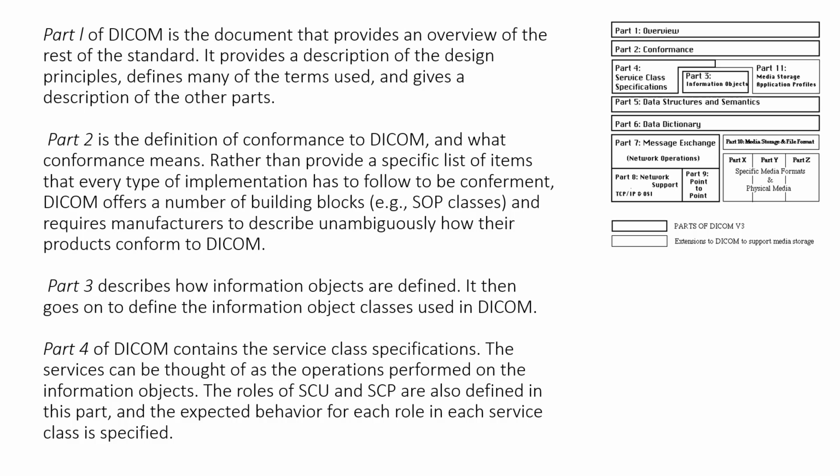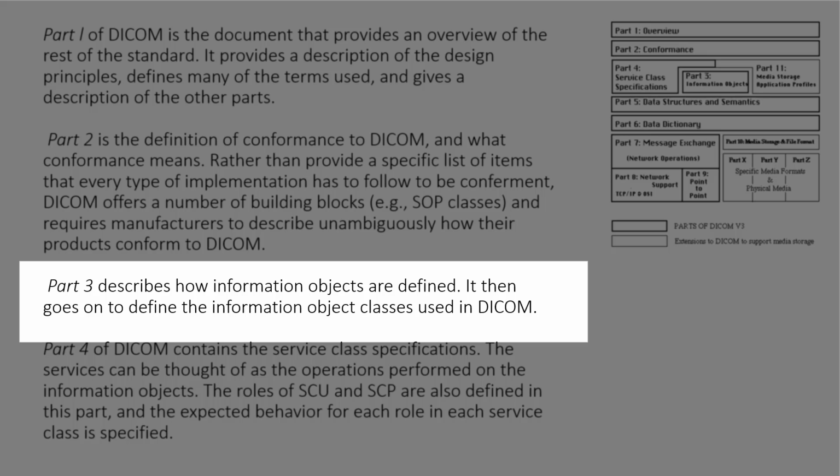Part 3 describes how information objects are defined. It then goes on to define the information object classes that are used in DICOM.